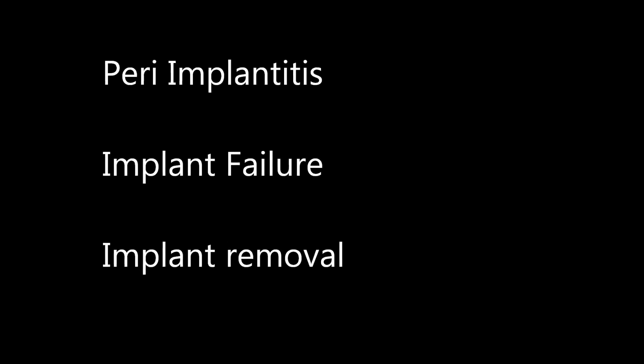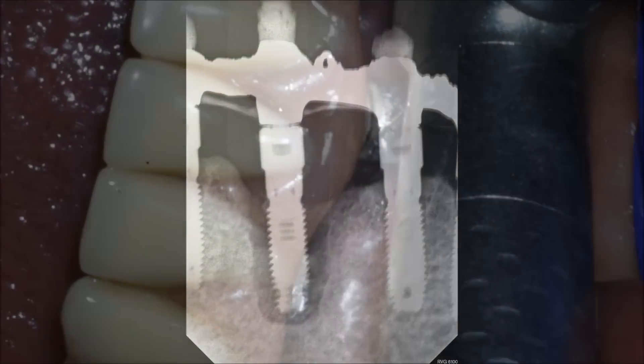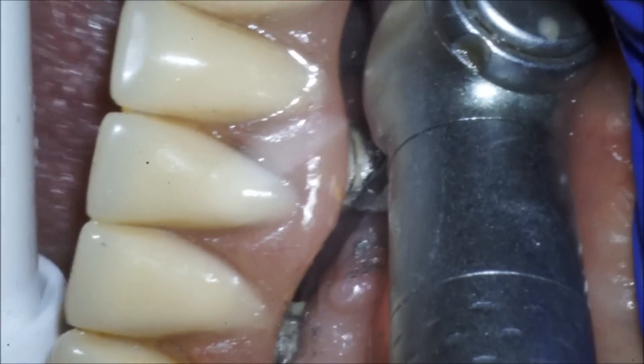This is a case of peri-implantitis — this implant is failing. You can see the x-ray right here, and there is no bone support. There's quite a bit of infection around this implant, so we've decided to explant it.